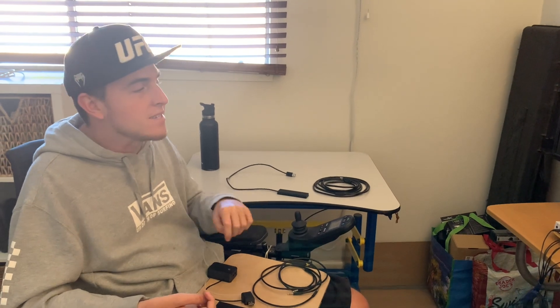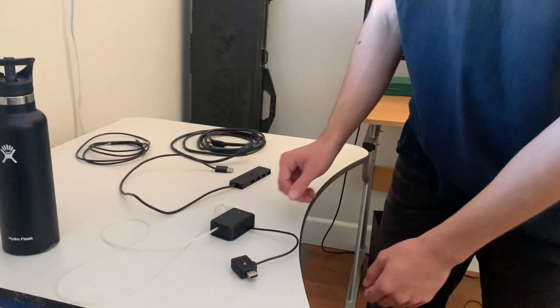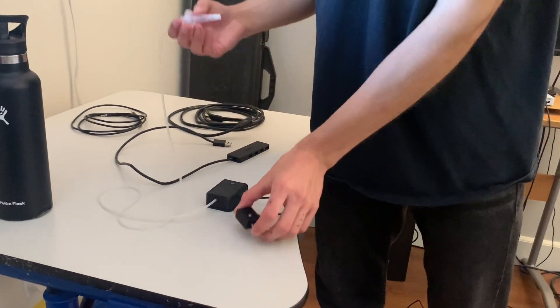Right now I'm going to stop the video, set everything up, and then once it's ready I'll show you how it works and some gameplay. I'll be right back. All right everyone, so all of the pieces are on this table. My brother Caden is going to help me plug everything in.